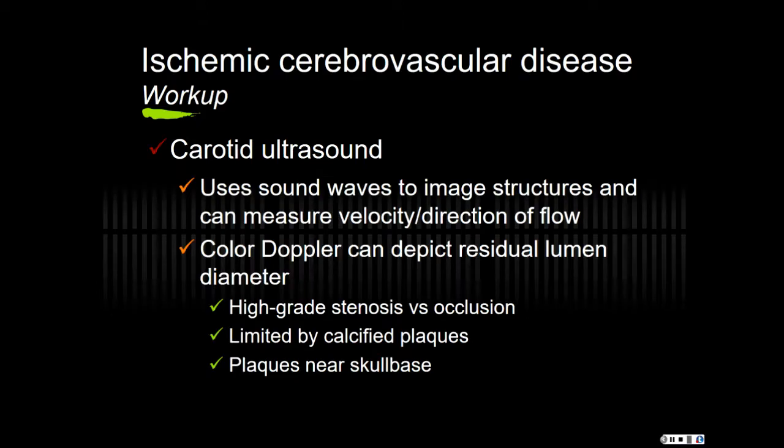All right. We can do carotid ultrasound also. These are still done. They're really not done out of the ER anymore because we've got the cross-sectional imaging in terms of the CT and MRI so widely available. These are good for follow-up. It's also a good screening tool when you listen to a patient's neck and you can hear little bruits, little whoosh, whoosh, suggesting an area of stenosis.